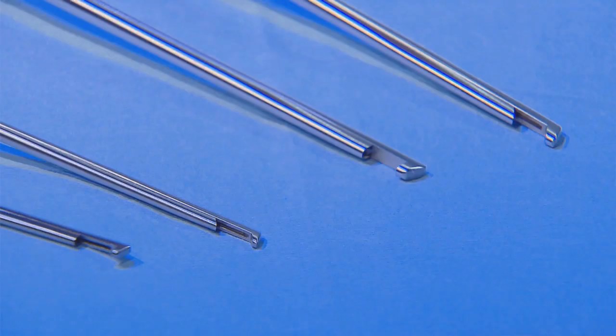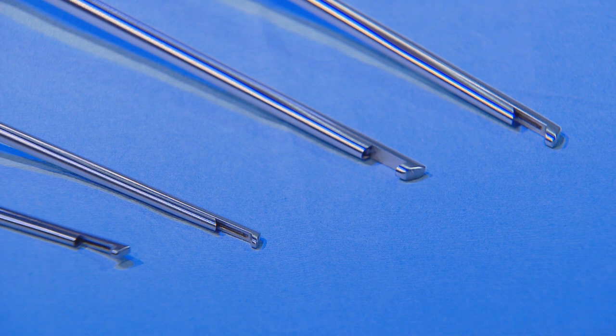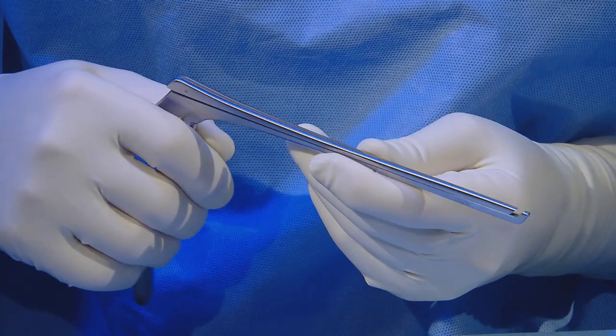Here we can see the 45-degree and 90-degree, 3 mm and 2 mm Kerrison forceps.